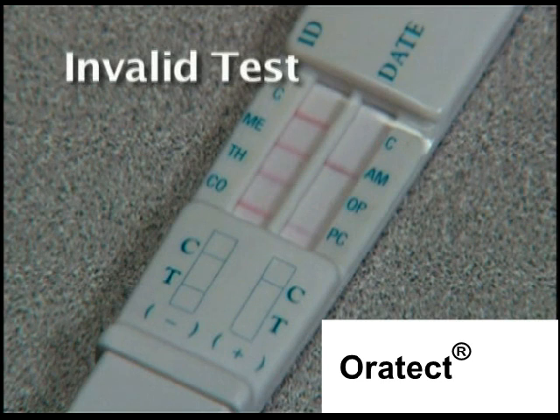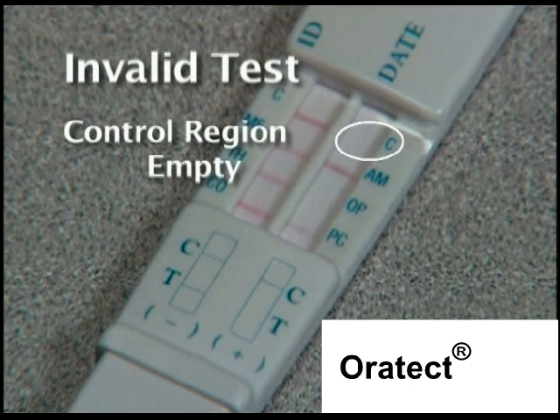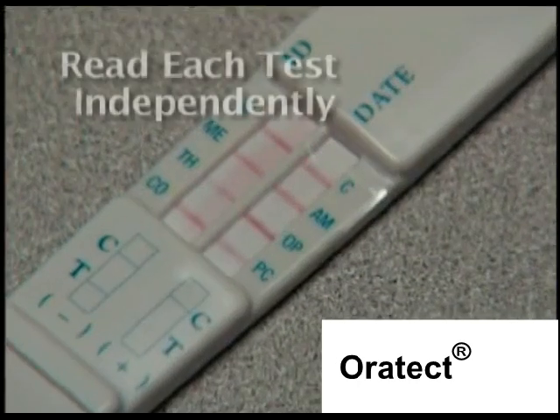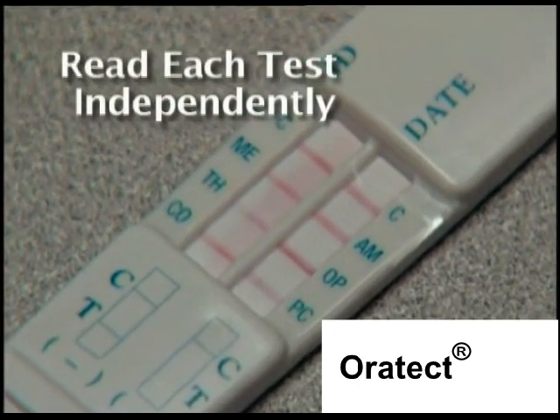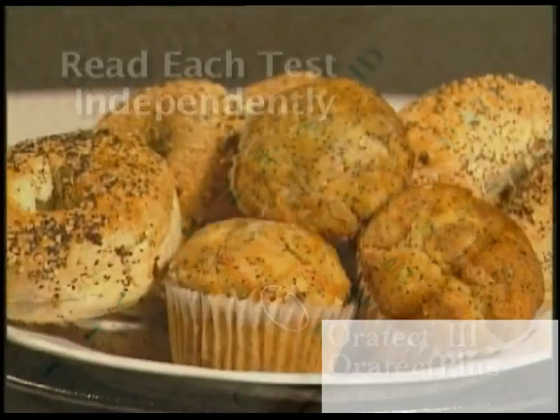When no band appears in the control region, the test is invalid, even if there is a band in the test region. In this event, repeat the test with a new device. It is important to read each test independently. Do not compare color intensity of one test to another. Samples with faint test bands at the test regions should be considered negative.